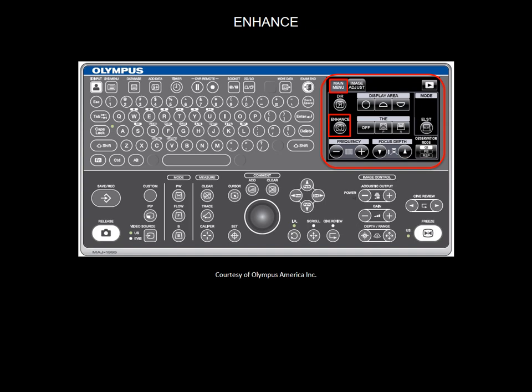When the enhance is on, the frequency is highlighted with a green background on your monitor. Enhance is an image optimize button, it gets rid of any noise.